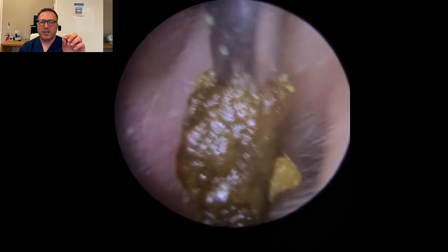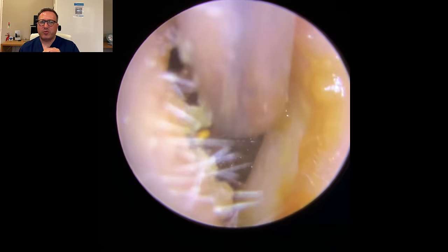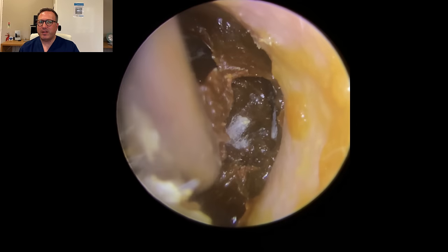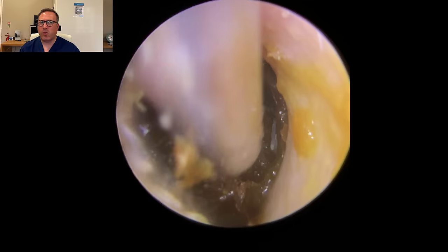You see a little bit of white material there to the right-hand side of that block of wax. There's a little bit of dry skin, which I'll explain in a second. What you'll also see is this little white patch in the middle - this is actually Q-tip debris. Where the patient's been using Q-tips to clean their ears, a little bit of the cotton has come off the end and embedded into the wax. You'll see a little bit to the right-hand side as well.